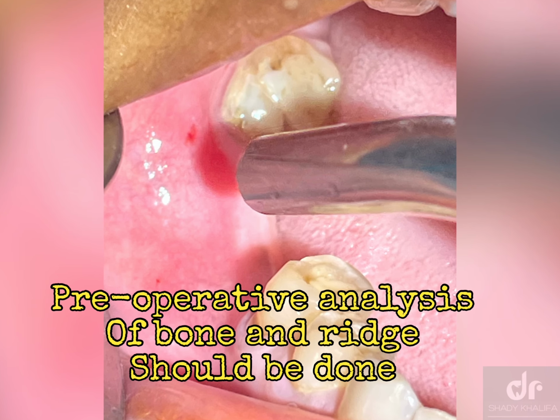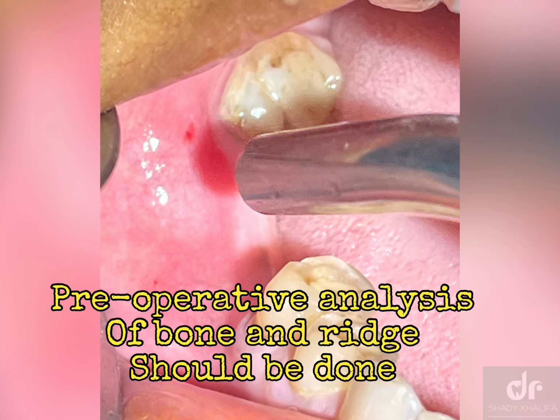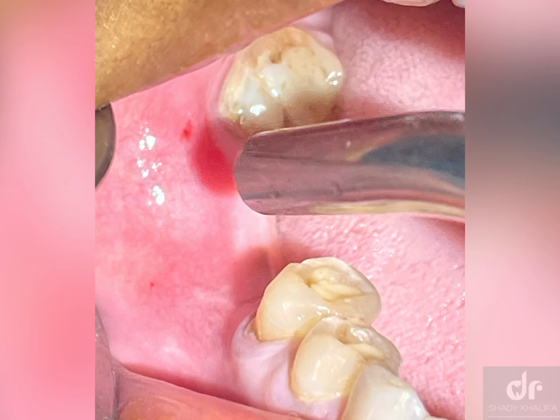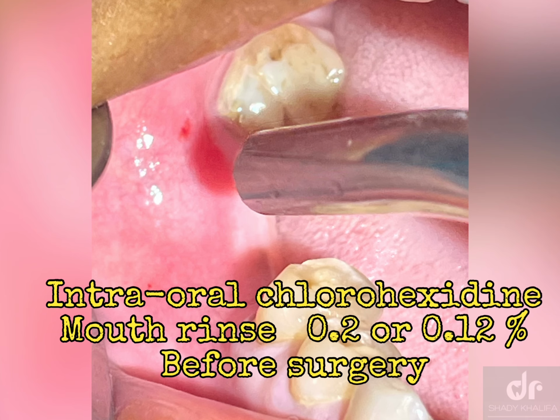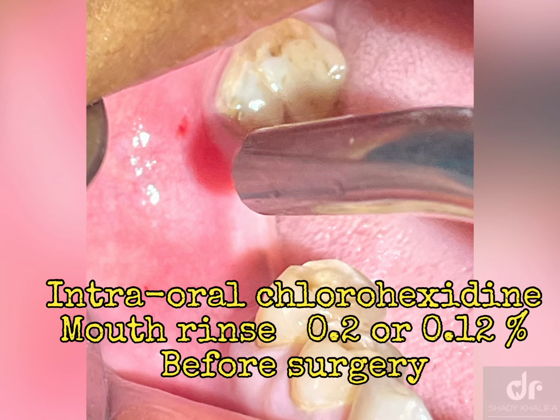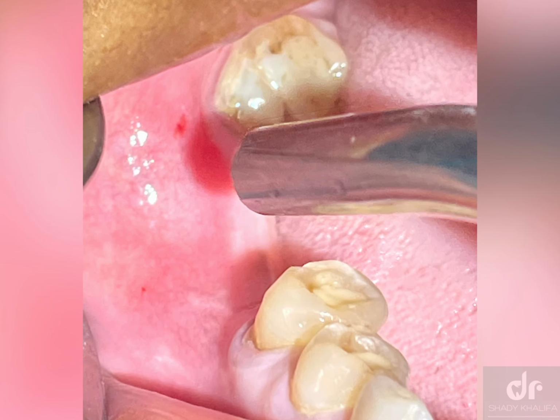Whereas the width is the buccolingual measurement, the distance from the buccal plate to the lingual plate. The length is the mesiodistal dimension, the distance from the mesial side to the distal side. So let's take a look at the X-ray.